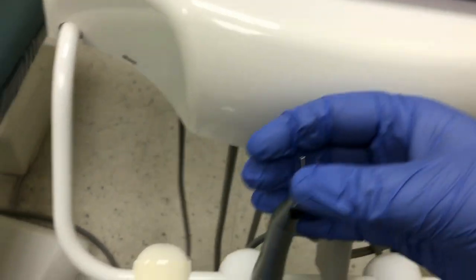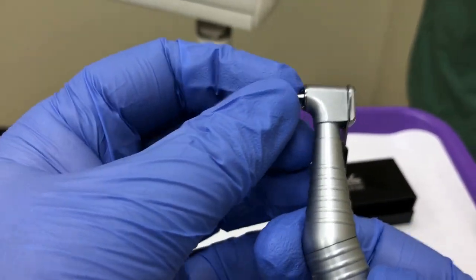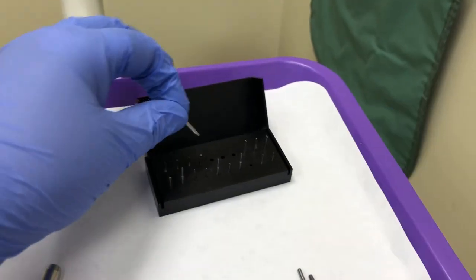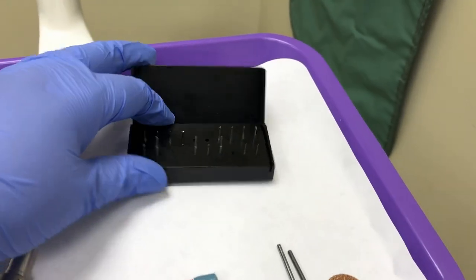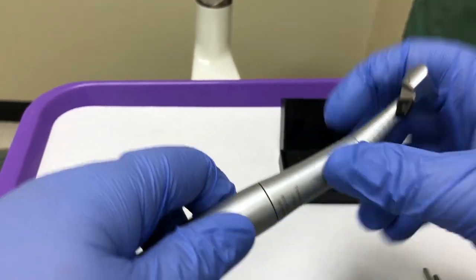To disassemble this handpiece, swing the latch lock open and remove the burr. Place the burr back into the burr block. After patient treatment, the entire burr block is taken to sterilization. To remove your contra angle, simply pull the two pieces apart.